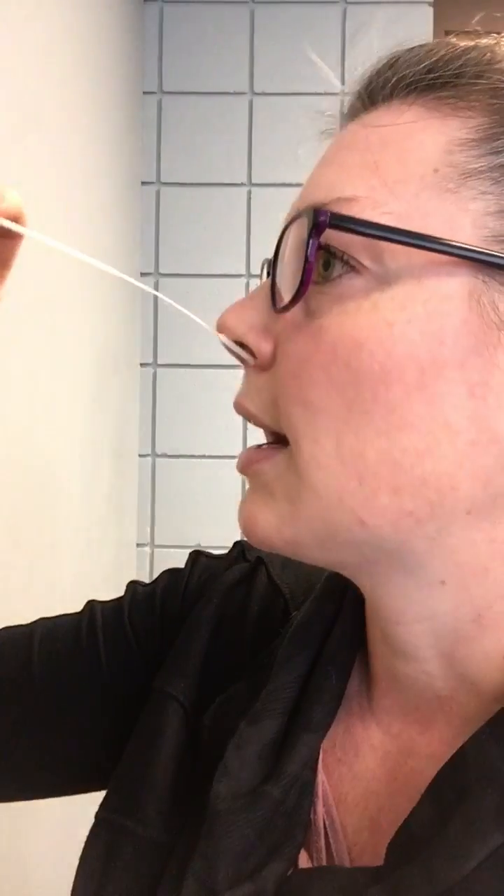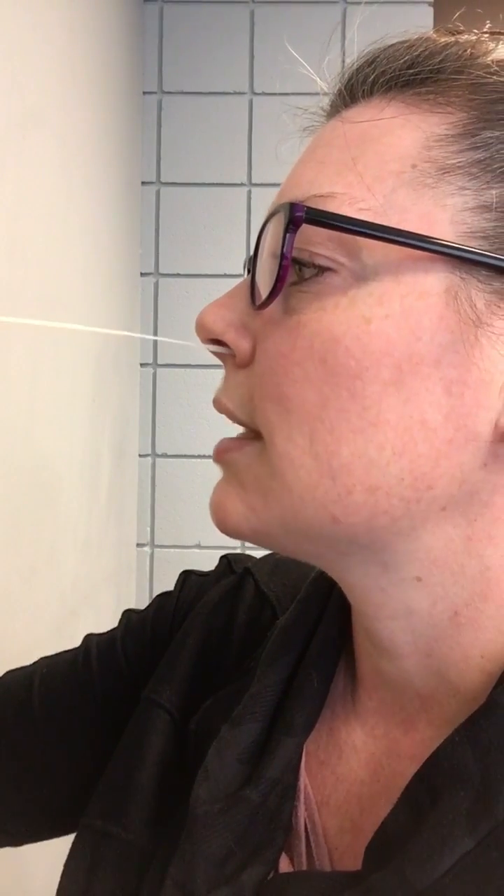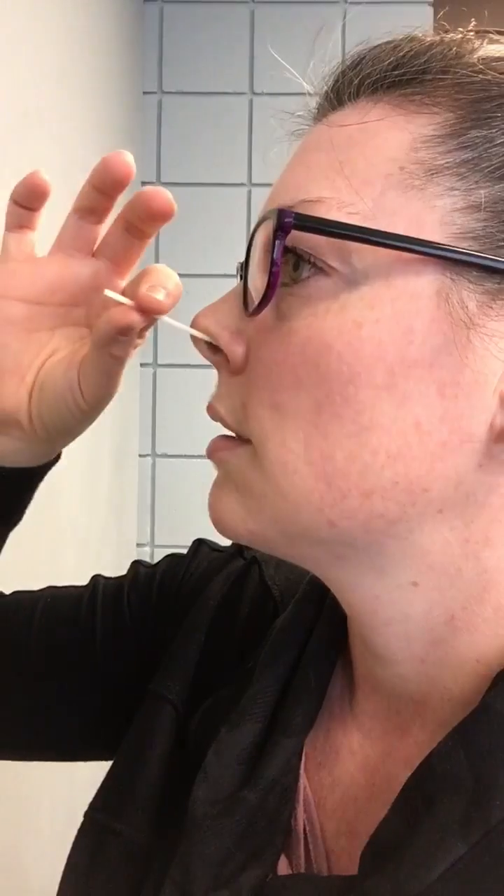The other approach: you can start high. If you start high you're going to hit the little lump, so just get in one centimeter then go straight down.